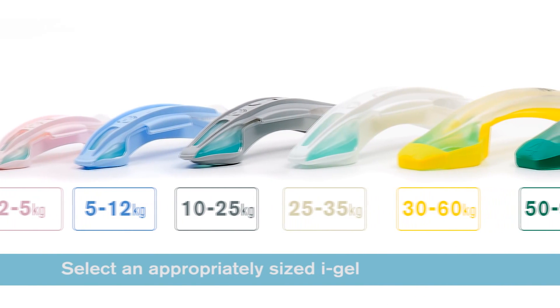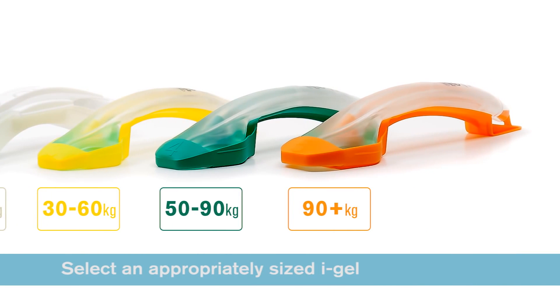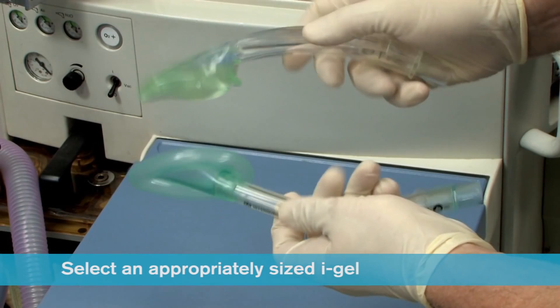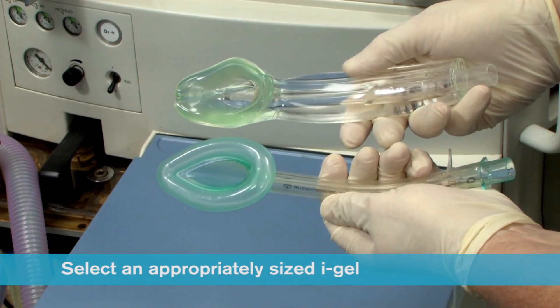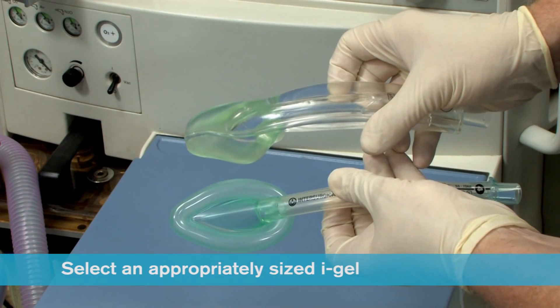Select the appropriate size iGel according to patient weight. When selecting size it should be remembered that the iGel cuff does look smaller than the corresponding size of many traditional supraglottic airways with an inflatable cuff.